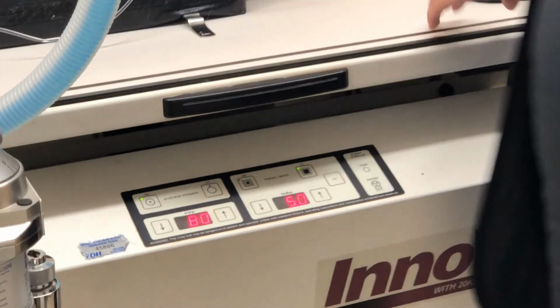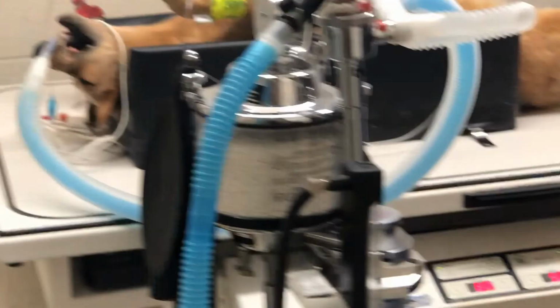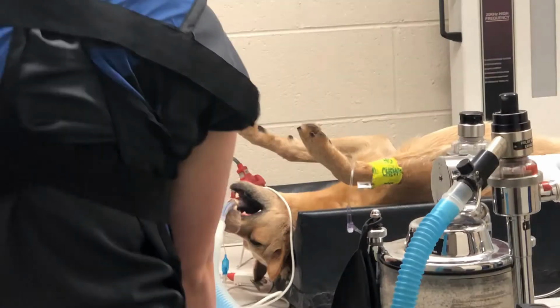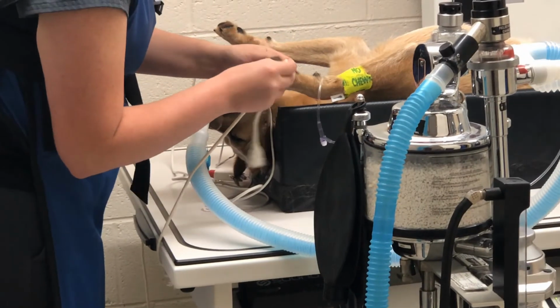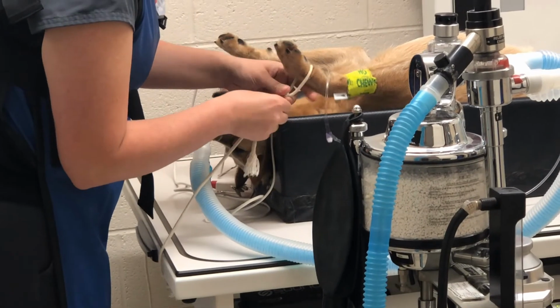Alrighty. Then we're going to tie the front half of Sadie in so we can create a little tension and stabilize her for when we're pulling on those back legs.